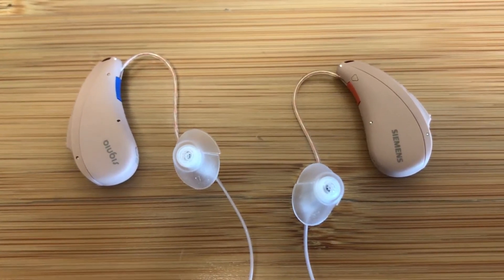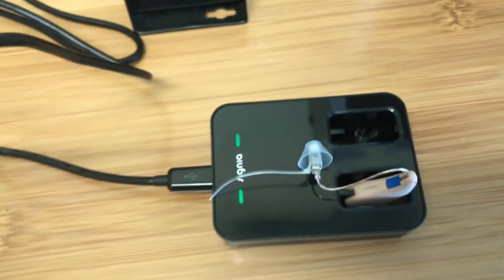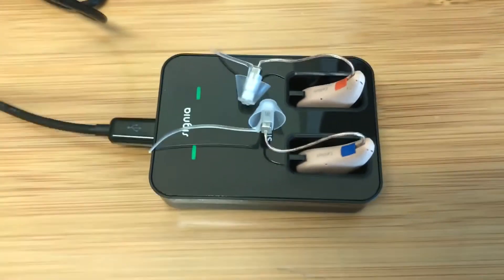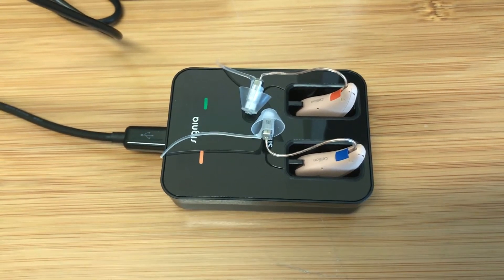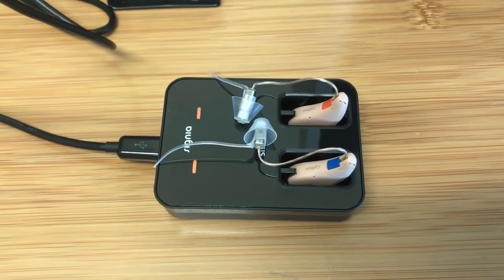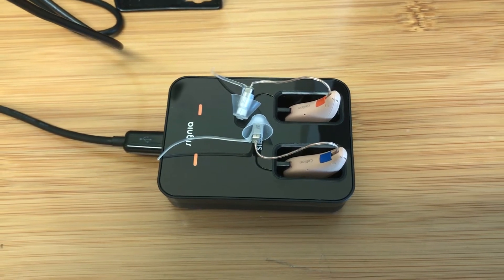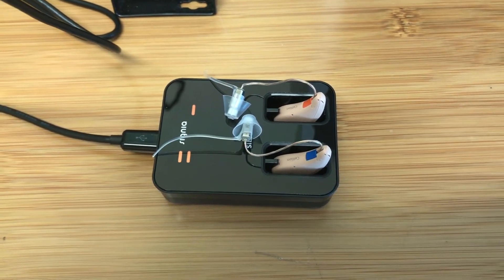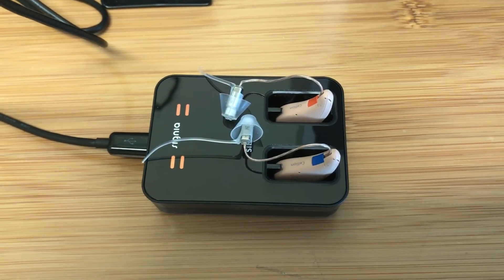What I really like about these hearing aids is there's no batteries for you to have to mess with. They have lithium-ion rechargeable batteries. You just drop them in the charger like this. Get in the habit of charging them up each night just like you do with your cell phone. One full charge lasts 24 hours. Now if you forget to charge them up one night and towards the end of the day the battery's getting low, throw them in the charger for a half hour and you get eight more hours of battery life out of them. So very convenient, very easy to use.